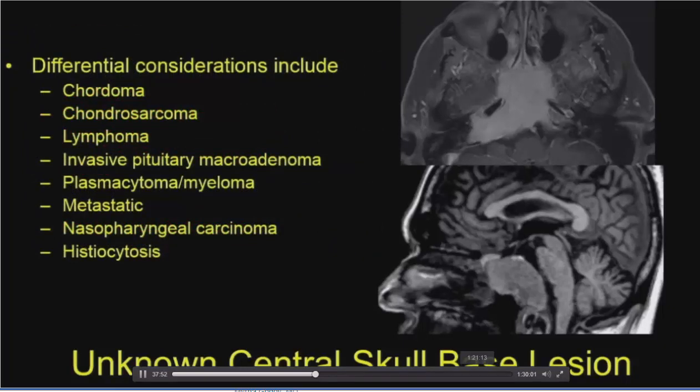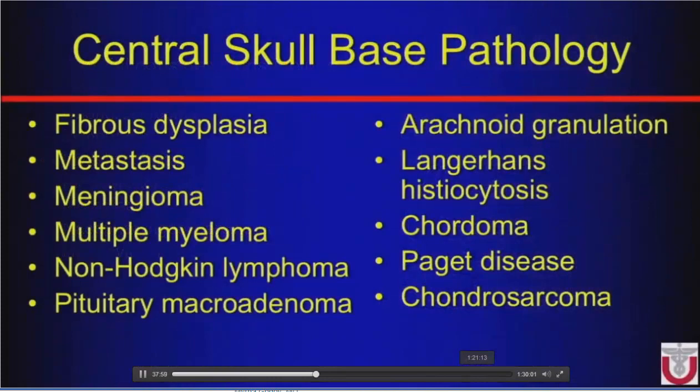Now, I kind of blame myself when I saw that my fellow had done this, because I had just given a talk about the skull base a couple days before, and I knew he had those slides. And I noticed that his impression looked a whole lot like this. So in some ways, I kind of had myself to blame. But he showed me the case, and I looked at the CT, and I looked at the MR, and I told him what I thought it was. And he told me later, he said, oh, you know that case I showed you last week? You know, they did a biopsy, and you were right about it. And I was cool about it. I said, oh, really? Well, even a blind squirrel gets a nut every once in a while.